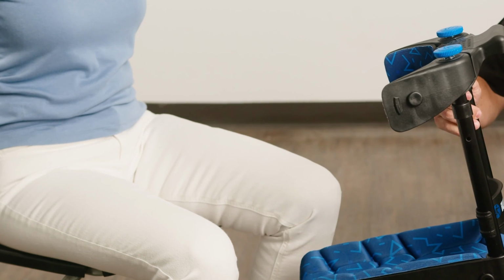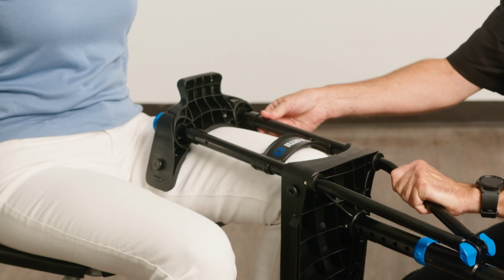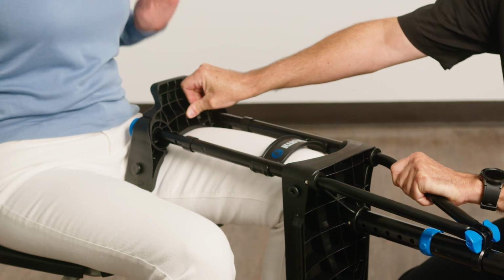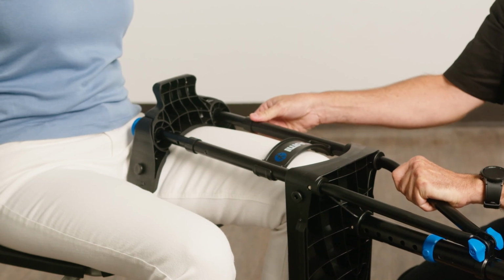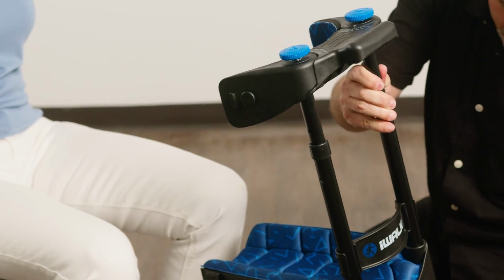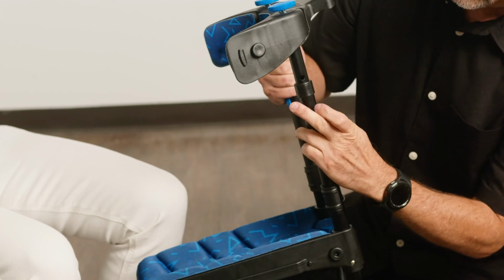Place the iWALK on the thigh of the patient so that the knee platform is pulled firmly against their shin. Then adjust so that the handle and thigh supports are as high as possible on the patient's leg. Remove the crutch from the patient's leg and push down slowly on the handle until the adjustment holes align. Then reinstall the blue C-clips.